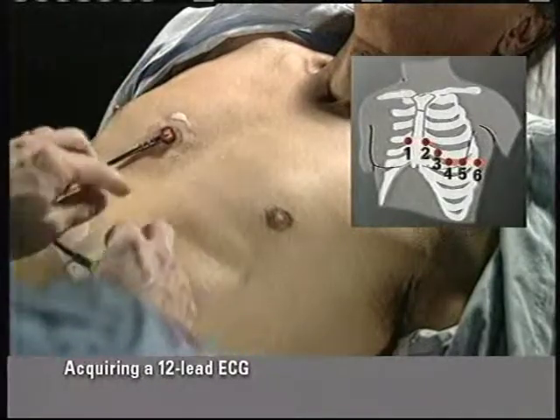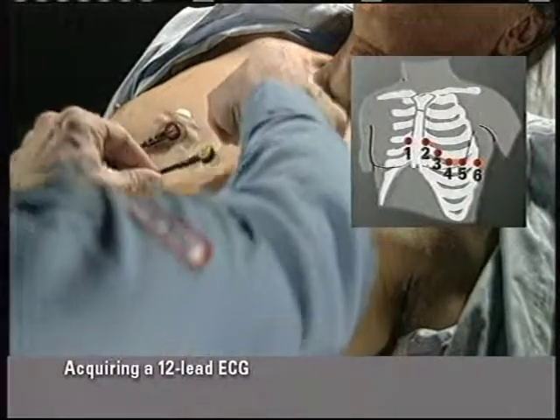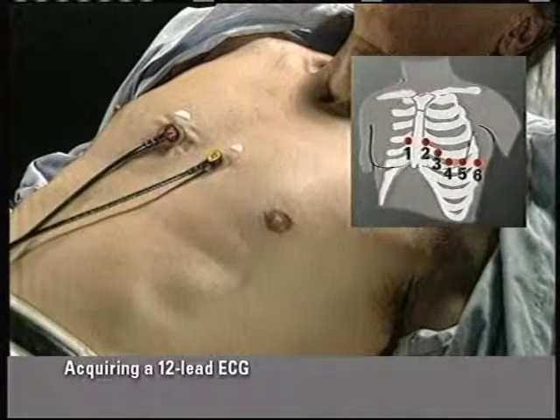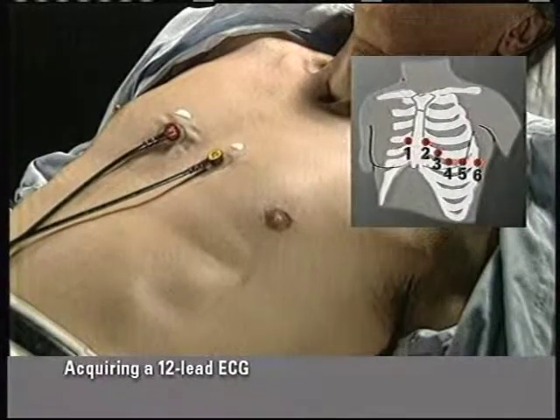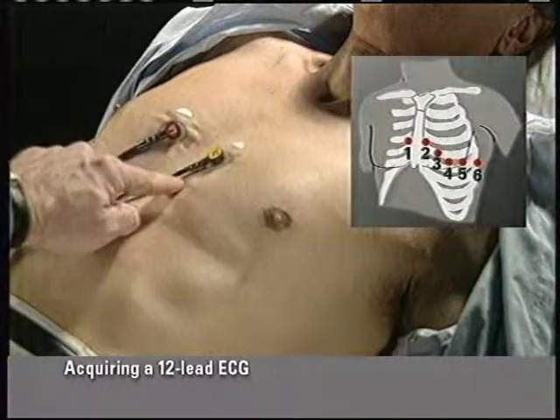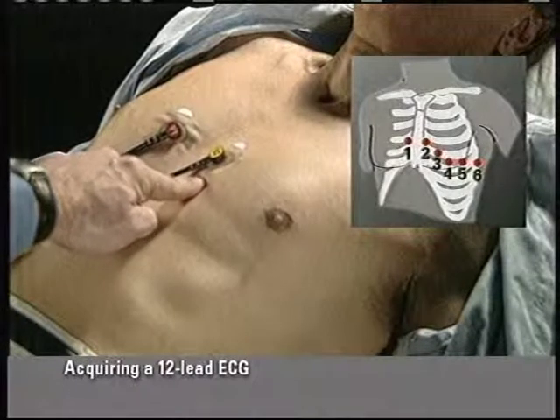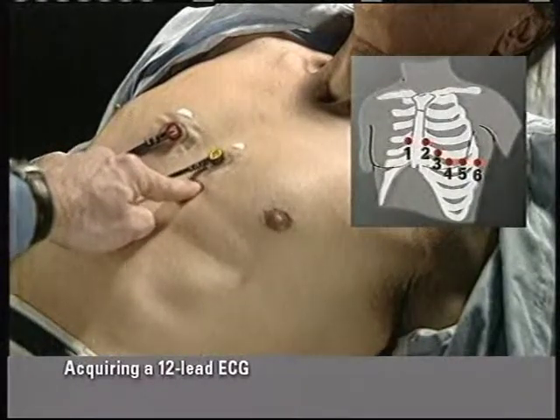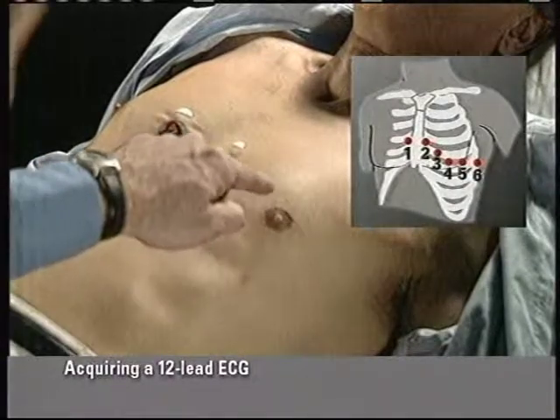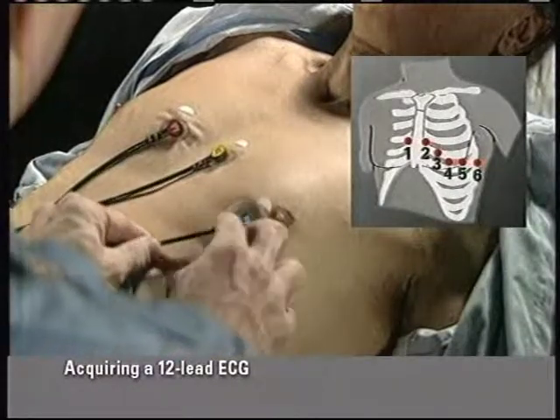Move across the sternum to the 4th intercostal space on the patient's left side. Apply the V2 electrode. Precordial lead 4 is located next because it is a reference point for V3. V4 is located in the 5th intercostal space at the mid-clavicular line. Find the 5th intercostal space by palpating for the intercostal space below the V2 position. Then follow this space with your index finger laterally to intersect with the mid-clavicular line. Place the V4 electrode at this point.